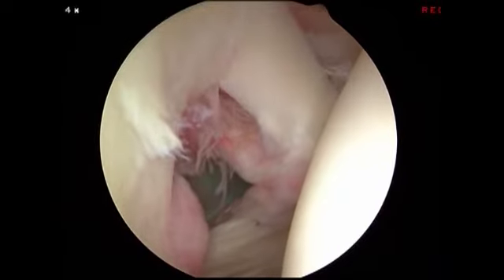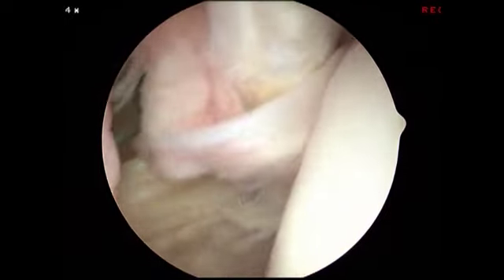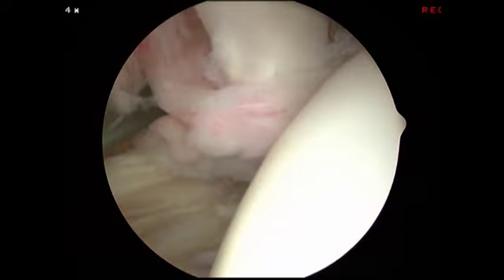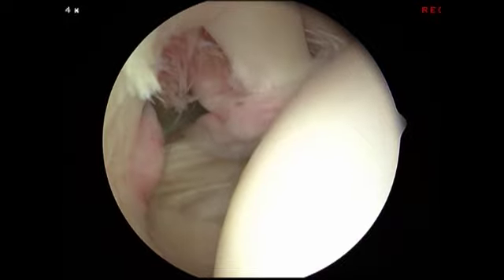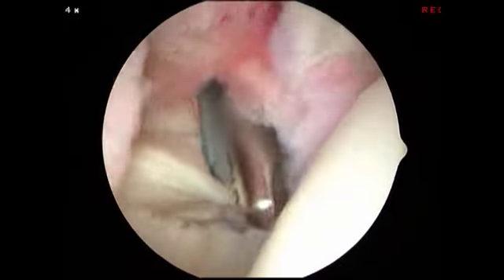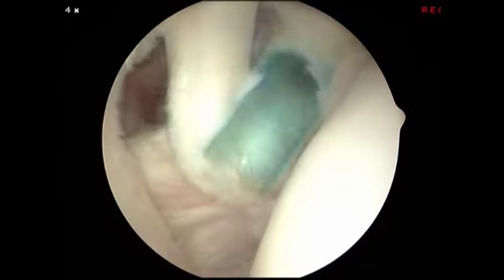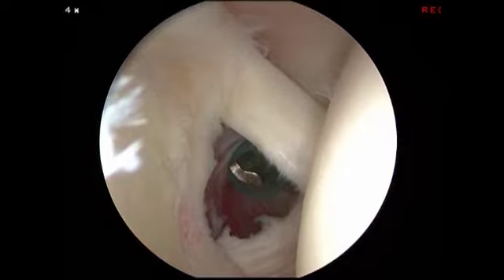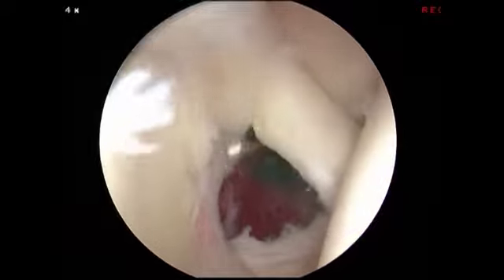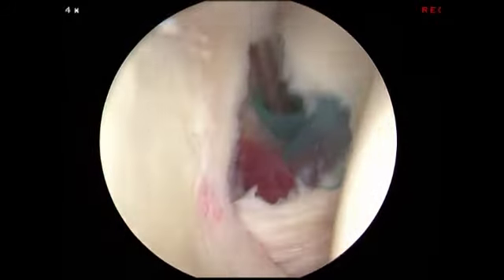Another different option for managing a subluxated unstable biceps is demonstrated in this example. Again, we can see a significant upper border subscapularis tear with exposure of the lesser tuberosity. The debridement is carried out and the rotator interval capsule is excised again. In this example, an accessory anterosuperior portal is placed to help us manage sutures. And then in this example, instead of incorporating the biceps into the subscapularis repair, it is removed from the field.